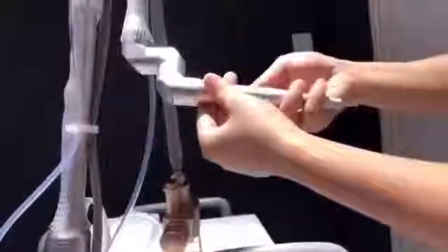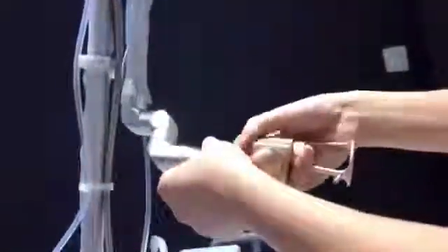Remove the pipe and remove the cutting head. Connect with the vaginal probe.